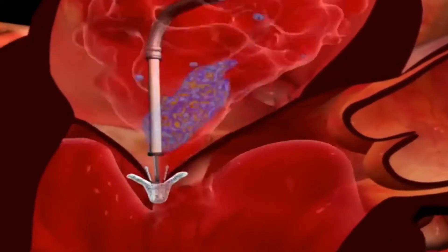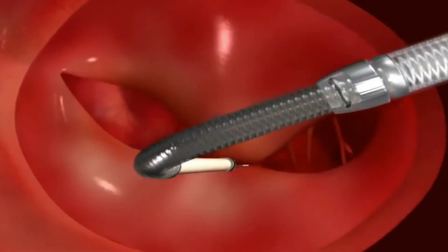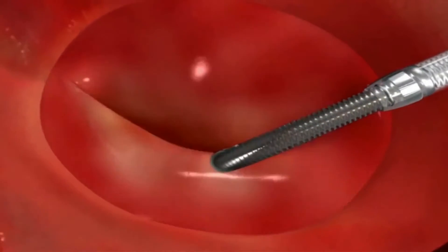So you can see in the diagram there that you're taking a catheter and pulling together the two leaflets of the mitral valve, and in a sense you're stitching them — so you have a much smaller area of leakiness than you had before.